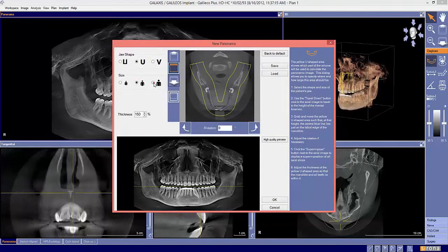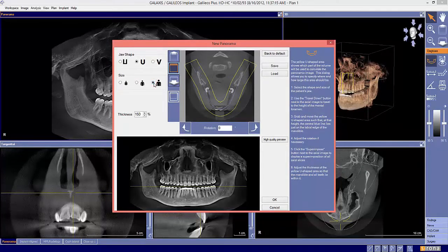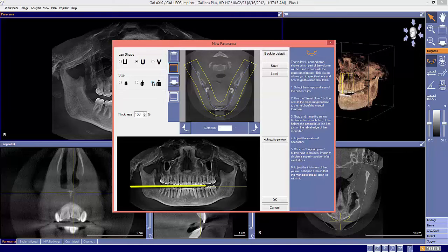Middle. Large. This will fit 90% of your patients. Then I'm going to ask you to move the yellow line down to the mental foramen.